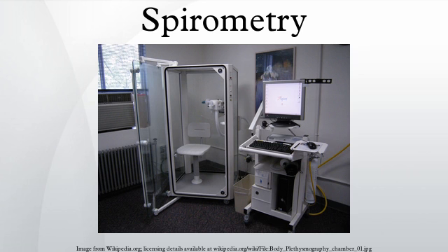Spirometry testing. Spirometer. The spirometry test is performed using a device called a spirometer, which comes in several different varieties. Most spirometers display the following graphs, called spirograms: a volume-time curve, showing volume along the y-axis and time along the x-axis, and a flow-volume loop, which graphically depicts the rate of airflow on the y-axis and the total volume inspired or expired on the x-axis.